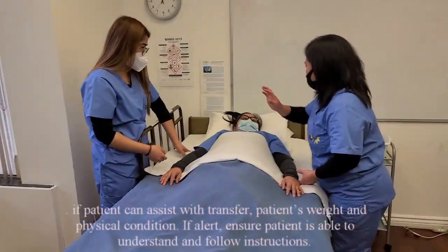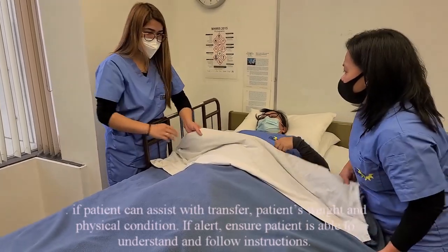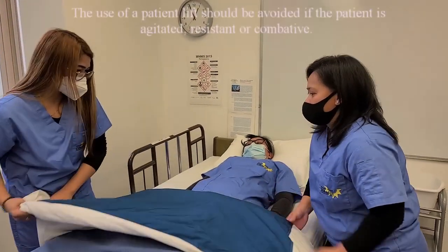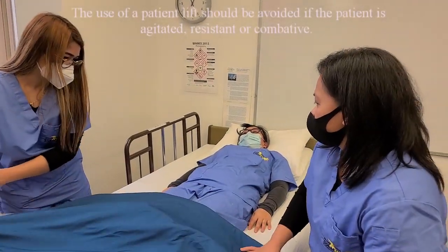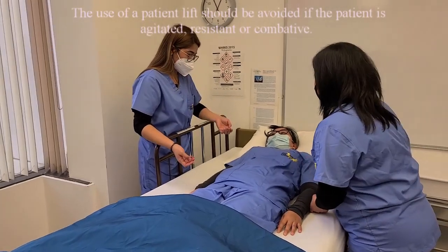Consider whether the patient can assist with the transfer, the patient's weight, and physical condition. If alert, ensure the patient is able to understand and follow instructions. The use of a patient lift should be avoided if the patient is agitated, resistant or combative.